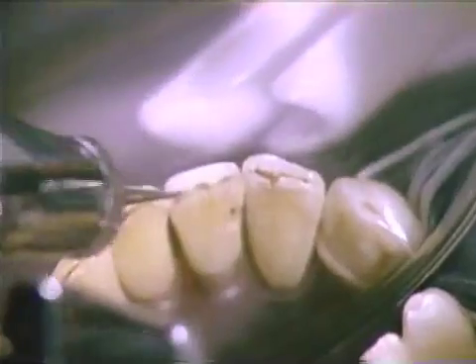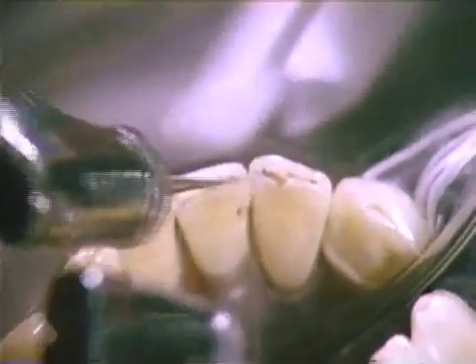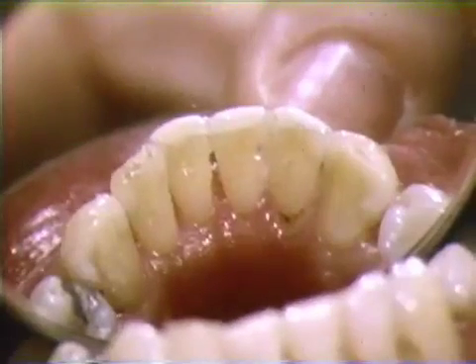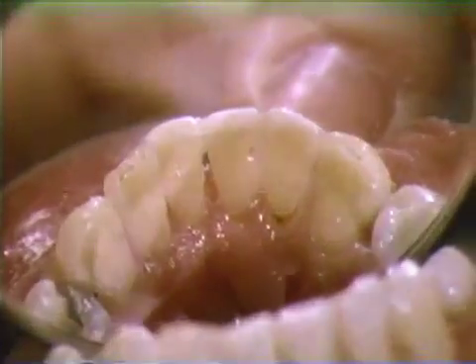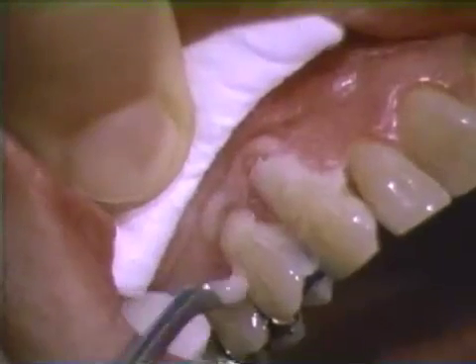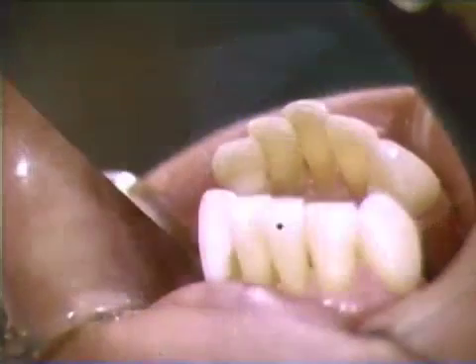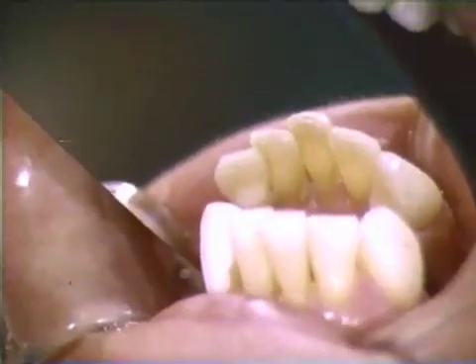The purpose of this program is to demonstrate the use of glass ionomer restorative materials for the restoration of various lesions in a post-irradiated caries active mouth, restoration of cervical abrasion without conventional tooth preparation, and recontouring of removable partial denture abutment teeth.